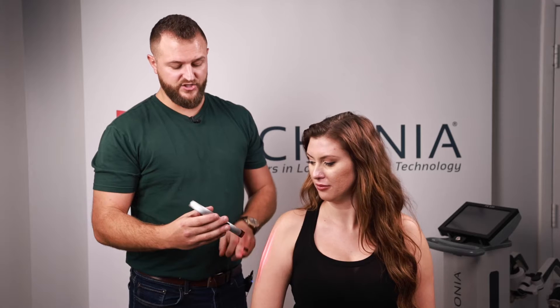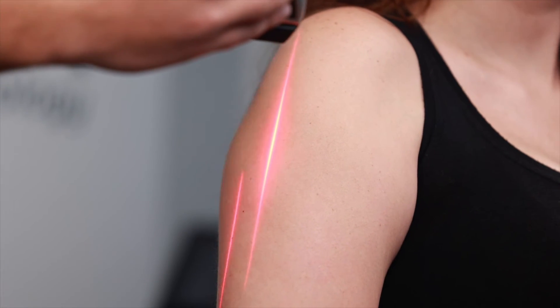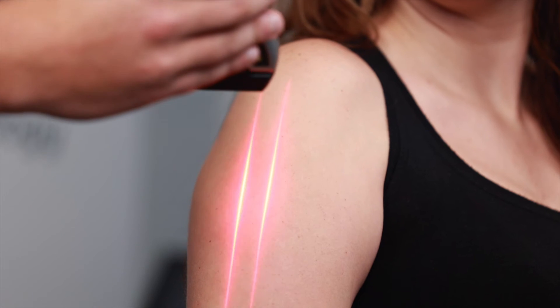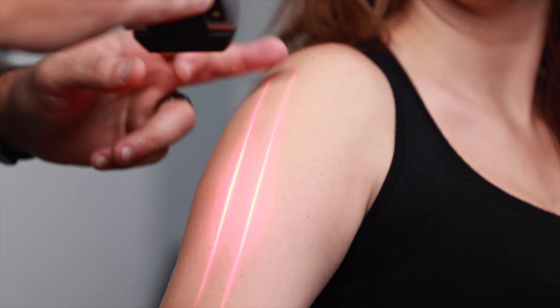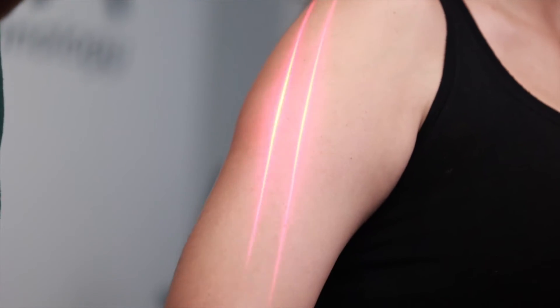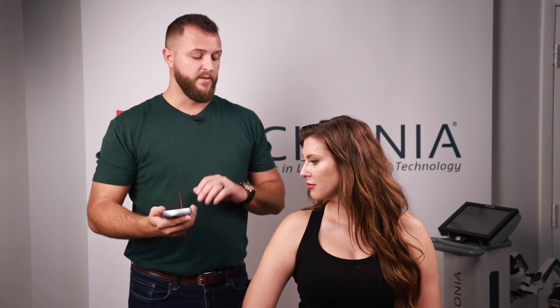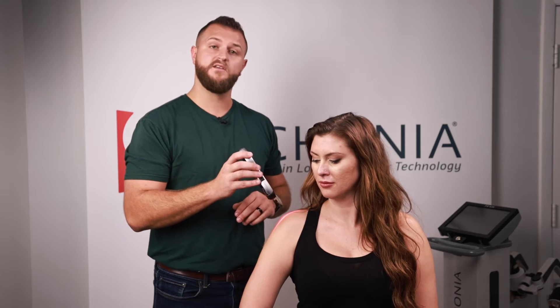Next let's discuss how to properly treat your patient. First, let's talk about distance from the skin. You'll notice the Urconia laser generates line-generated beams — these are patented and unique to Urconia, and they also act as a distance guide. The smaller the body part, the closer you get to the skin because the closer you are, the smaller the line-generated beam becomes. For example, if treating a finger, place the laser directly on it for maximum photonic exposure. If treating an entire arm, stay about six to eight inches away to cover the whole area with the laser beam.